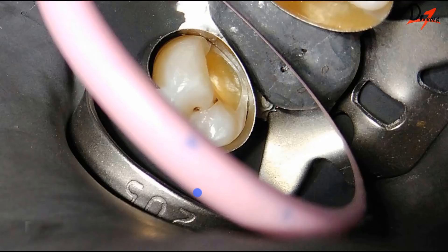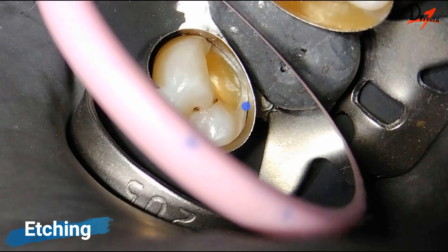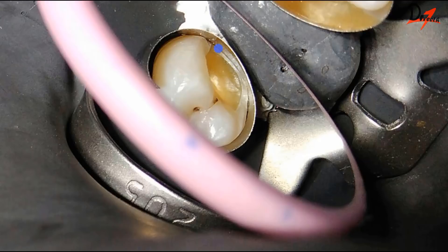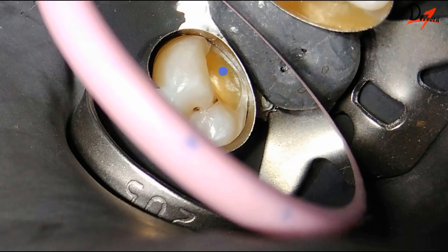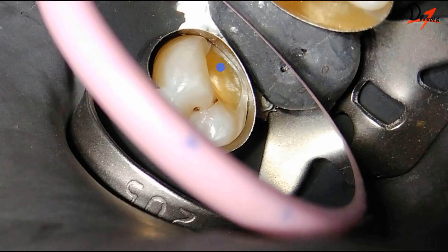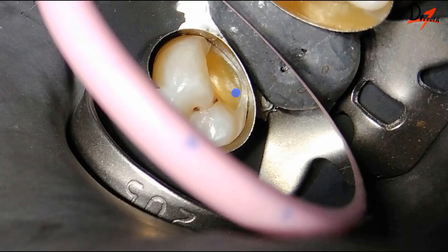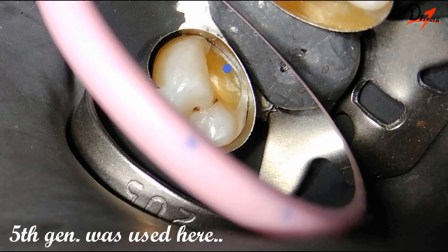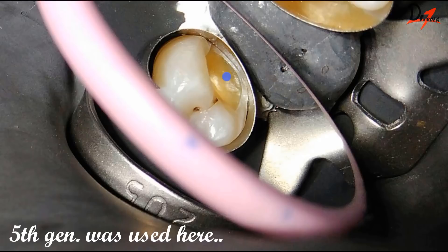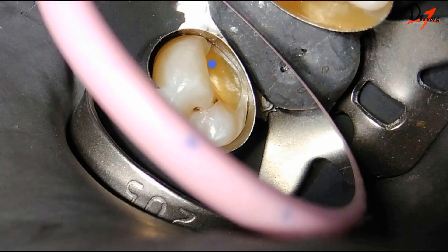Selective enamel etching was carried out on the periphery for around 30 seconds and on the dentine for 10 seconds, then thoroughly rinsed. After rinsing, the tooth surface is dried using an indirect air blast. The bonding agent was then applied and scrubbed on the tooth surface, then evaporated using a gentle blow of air.